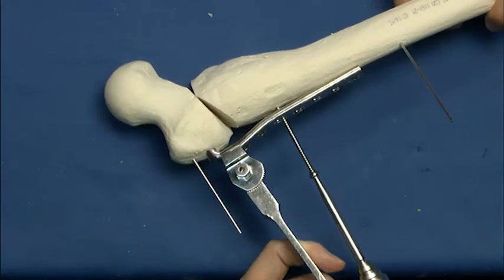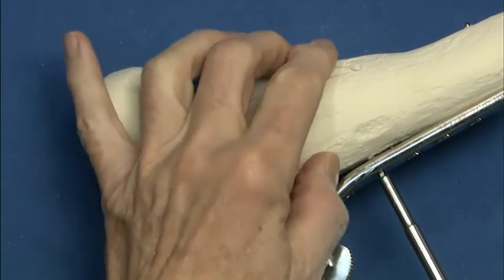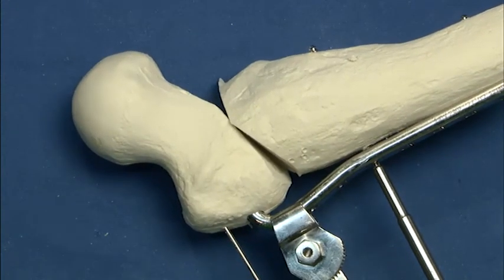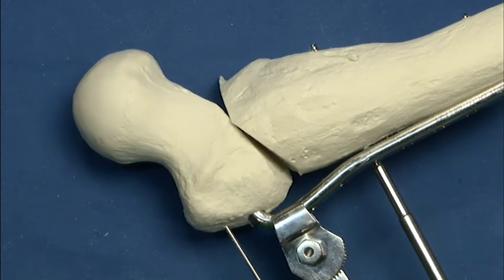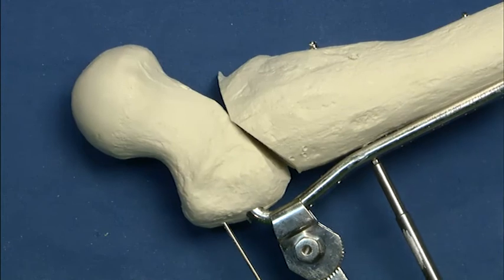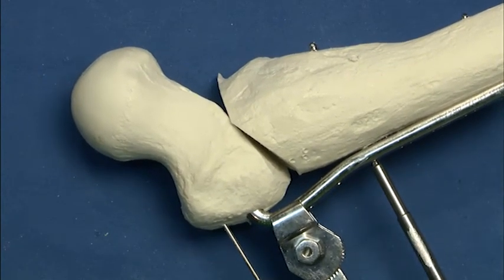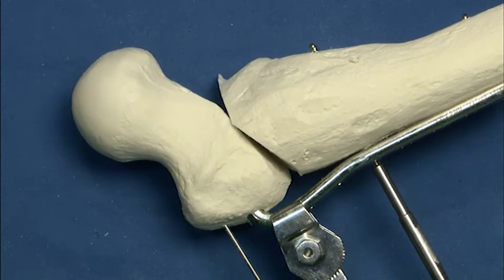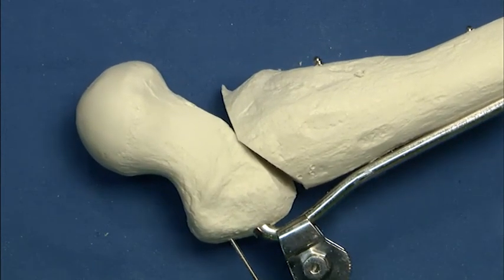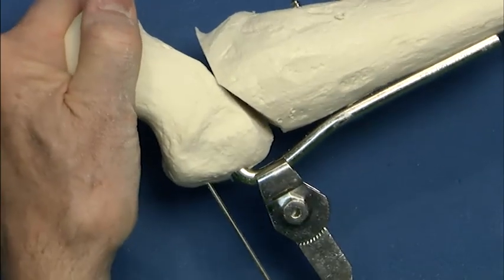So I'm going to put one in here and we'll see. So what will happen as we tighten this progressively, we'll translate and generate compression along this oblique plane. We're about to reach the yield point of this plastic bone. We're fully seated now, and what was previously torsionally unstable is rock solid now.